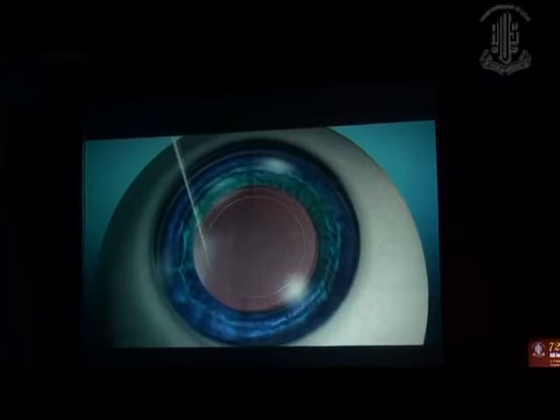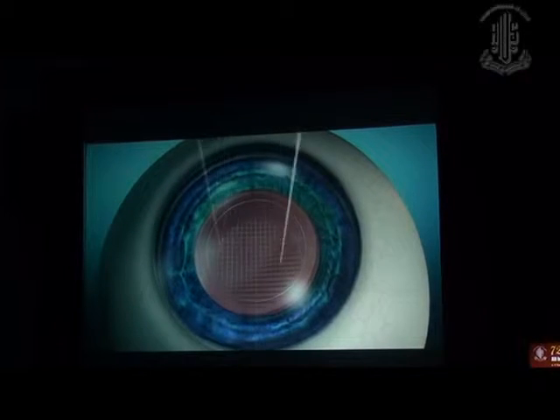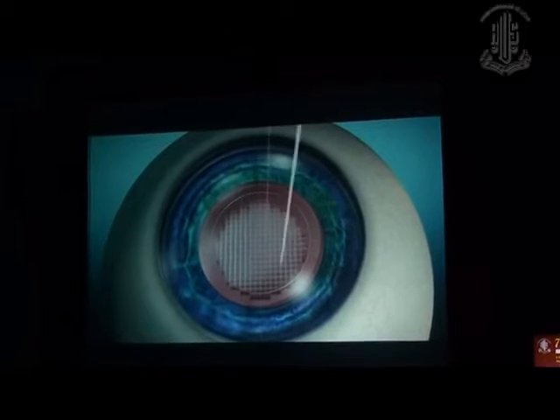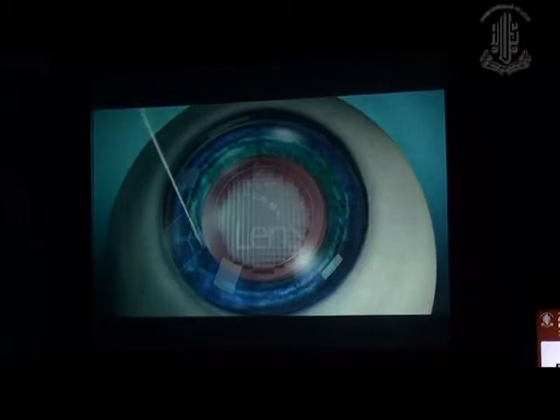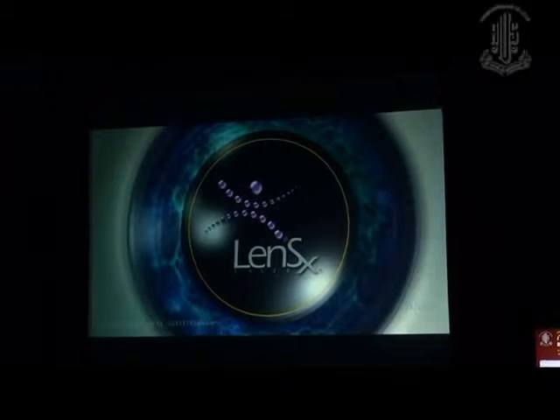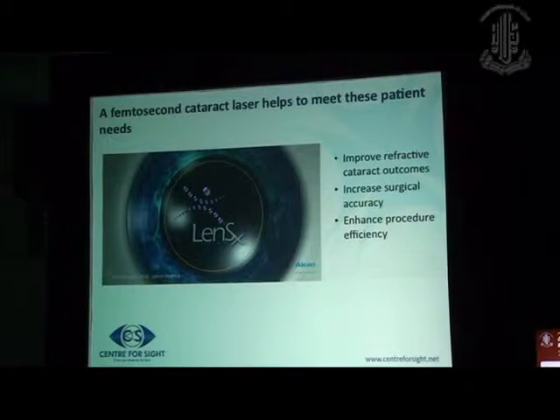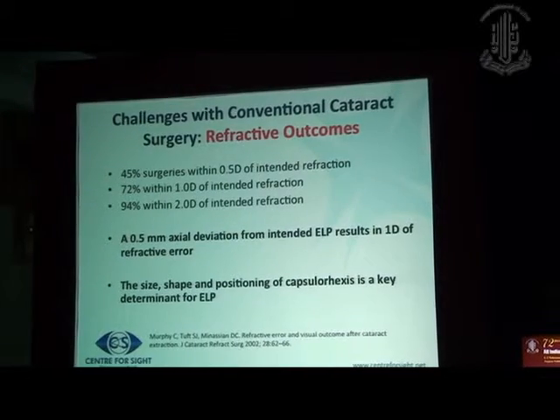A femtosecond laser incision is produced by performing thousands of laser pulses every second. This produces continuous, tightly controlled tissue separation. By adjusting the depth, size, and location of each pulse as it fires, the laser can create cuts on multiple types of tissue. Okay, that essentially was how a femtosecond works, because we've been talking about femtosecond.